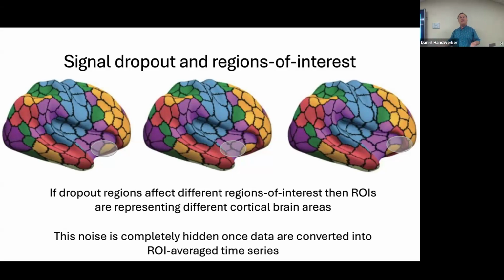There are acquisition methods that will reduce your dropout or change where your dropout is. So let's say you were really interested in the amygdala, which is an area that sometimes has a lot of dropout. Then at the acquisition stage of a study, you should spend a lot of time saying, let me make sure I'm getting amygdala signal as robustly, reliably and fully as possible.